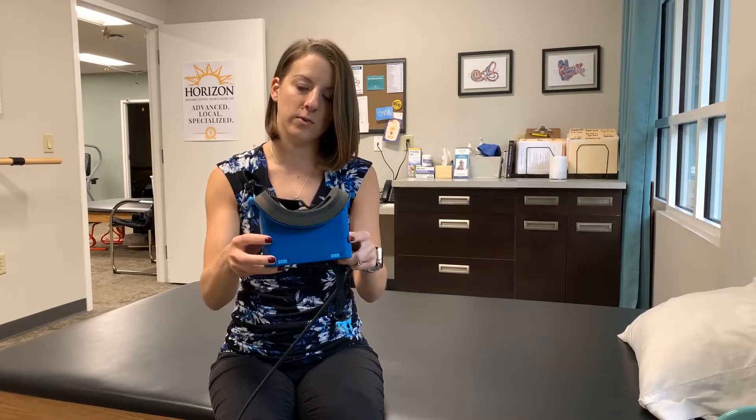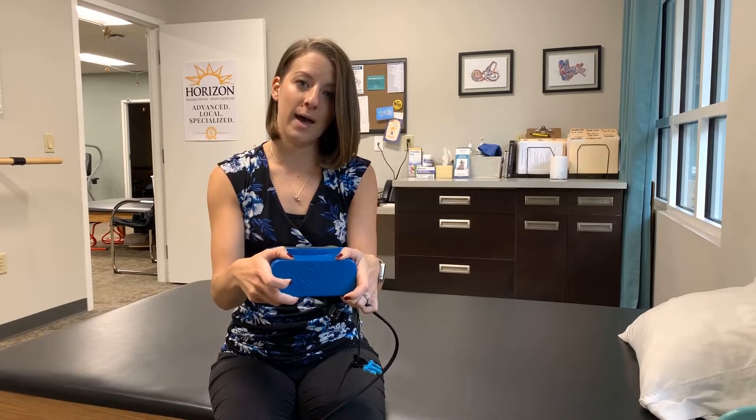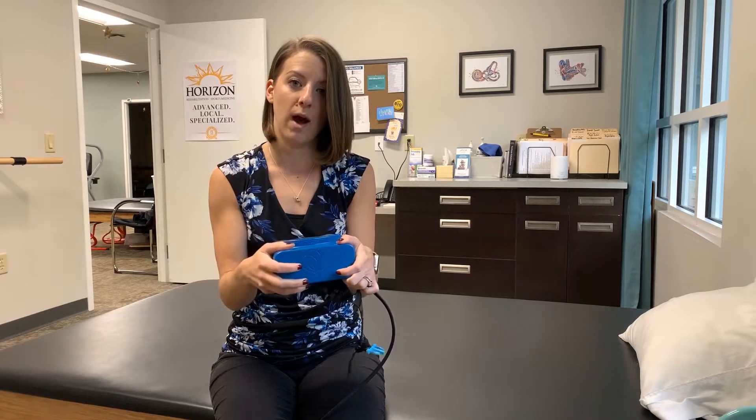Another unique feature is that you can add fixation right on the goggles. There are little switches on the top that say on and off, and you can switch them on and off for each individual eye to give the patient fixation while in the goggles while recording their eye movements.